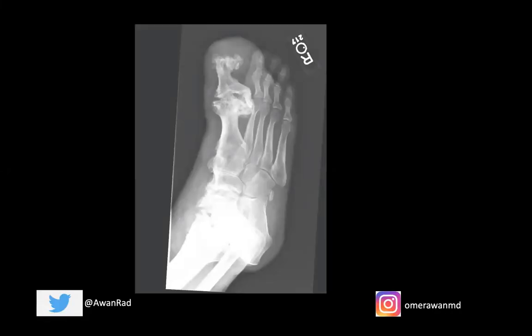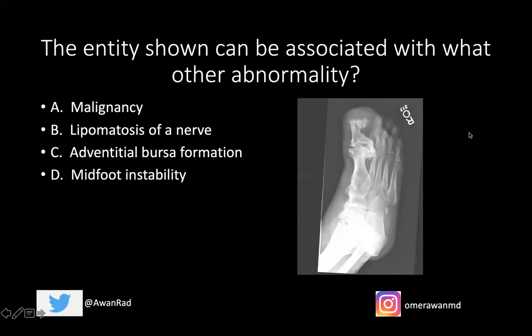Hello everyone, and welcome to week 11 of MSK Unknown Case Series. This is the case for this week — a fantastic case. This is a frontal view of the right foot in a 23-year-old individual, and the question for this case is: the entity shown can be associated with what other abnormality?